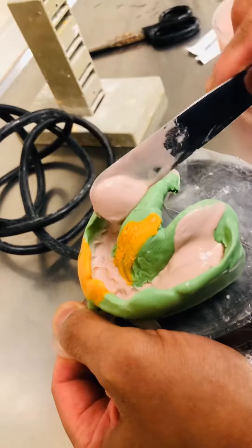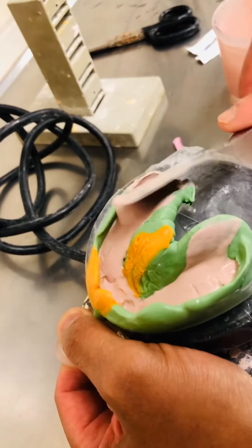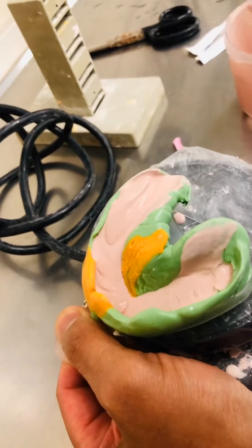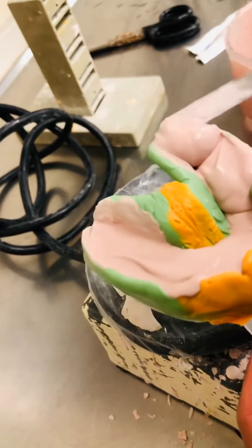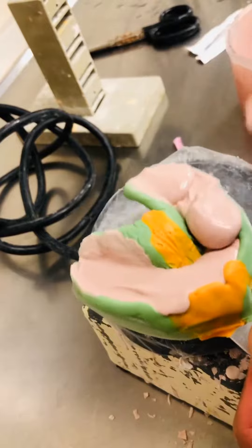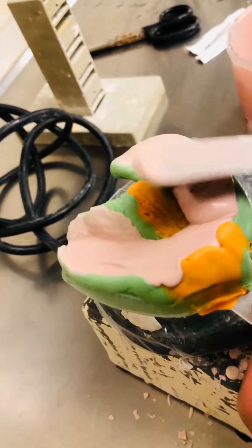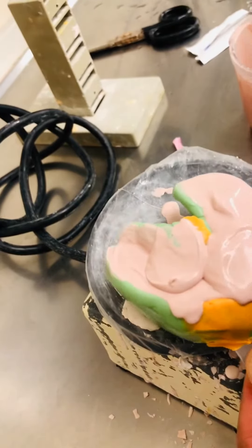I'll pour it up. My goal for this case is to be done in two days, and that's including the stone work and the die work. Once that's done, I will start waxing up again. I'm pouring it up and I don't need a thick base because I know I'm going to trim it.